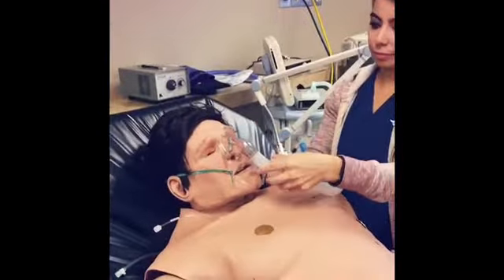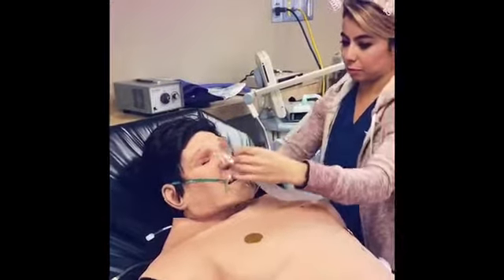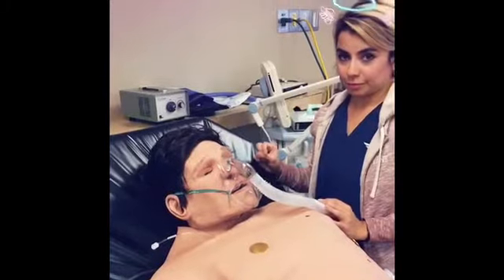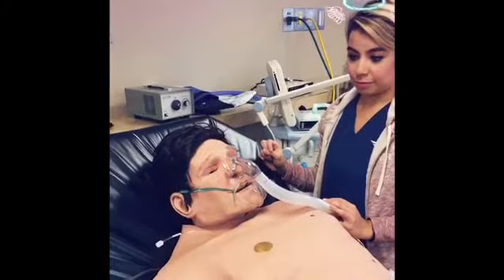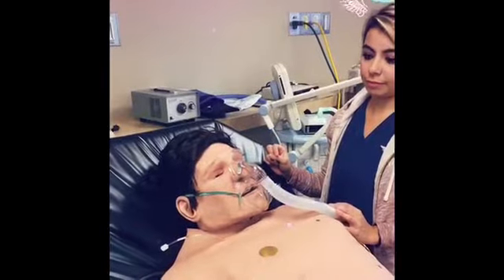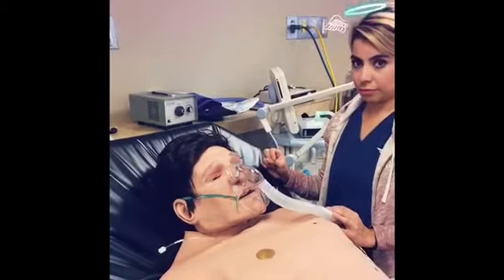Hazards include CO2 buildup with low flow rates. Do not ever use this at less than 6 liters per minute. When using this mask, consider humidification to keep the patient's mucous membranes from becoming dry. Face masks are used to deliver oxygen to people who don't otherwise get enough of it. They are commonly used to provide relief to people with respiratory disorders.